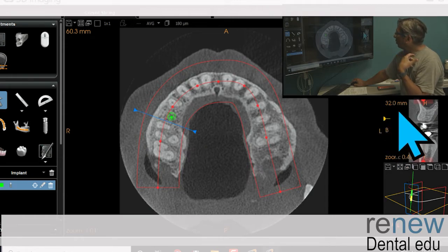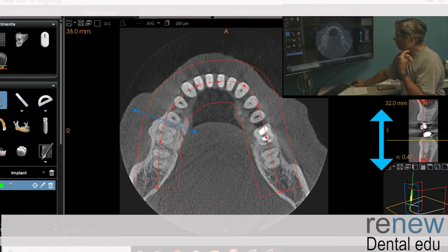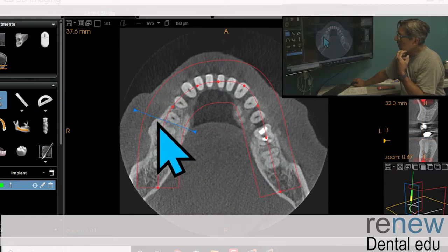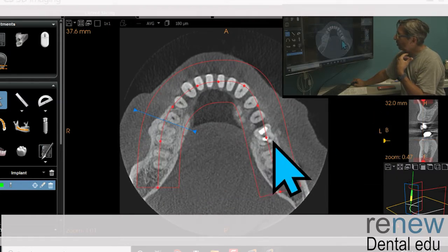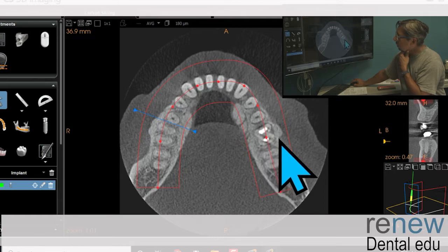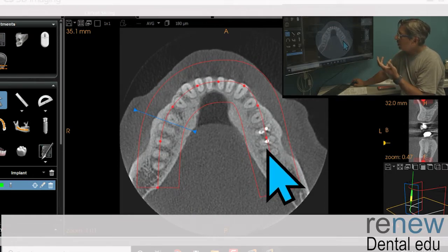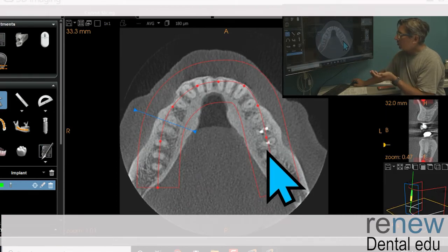Let's look at the lower arch actually too. That's got to be a lot of stuff going on. Look at that, right on that first molar here. We're going to go down. I would not be surprised if that was less than 10 years old. This root canal treated tooth, he's just going to crush it. He's going to crush it. So he's crushing his front teeth.